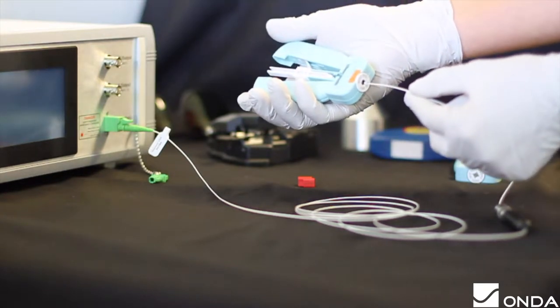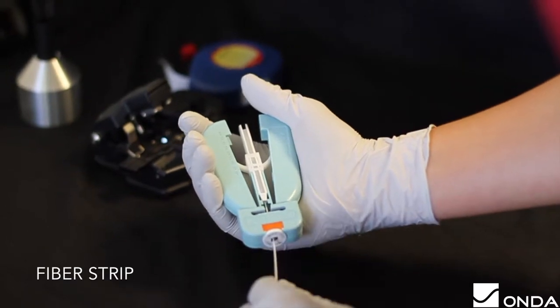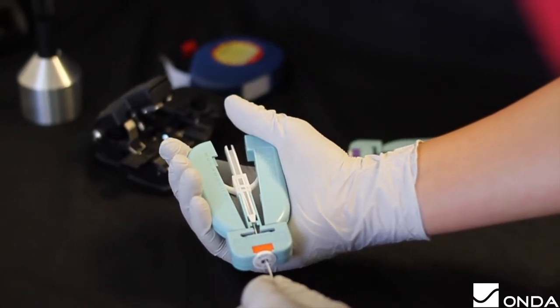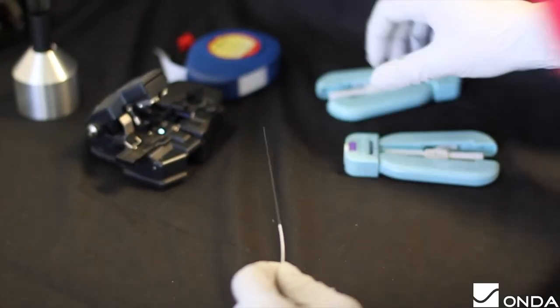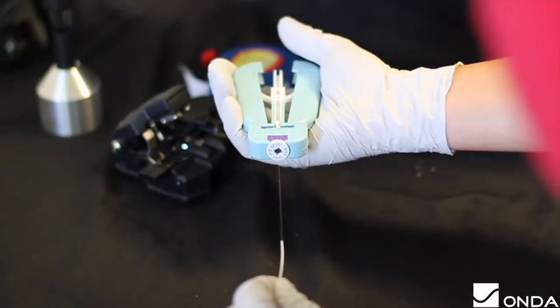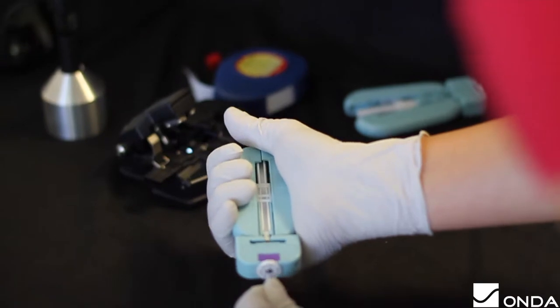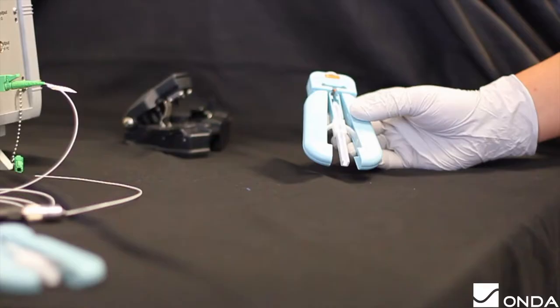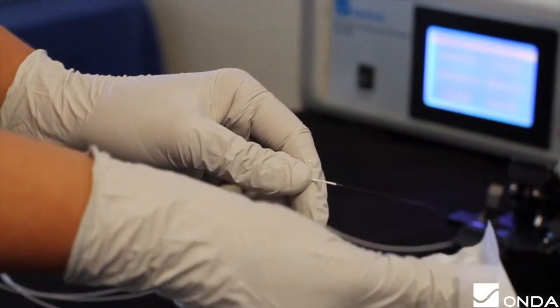To prepare the fiber tip for the DC offset calibration, cleave the outside sheath with the 0.16mm microstrip, which can be identified by the orange tape, and push the fiber to 45mm. Then repeat the same steps with the 0.06mm microstrip, which can be identified by the purple tape, and push it to the bottom of the tip. Gently tap or use an air gun to clear the microstrips of any remaining debris.